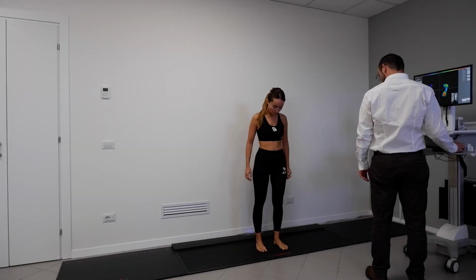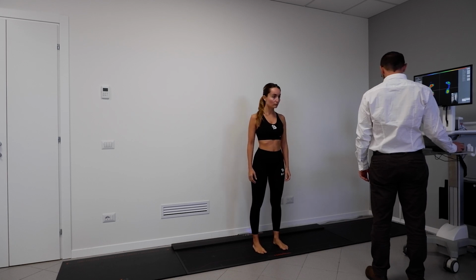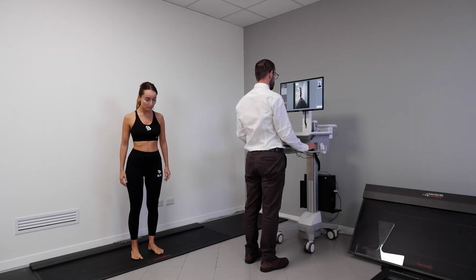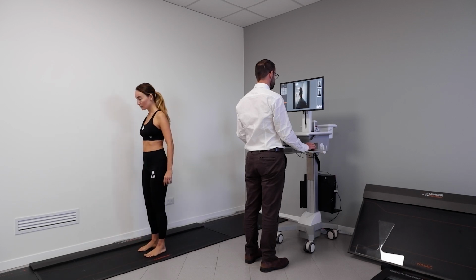Following the classical literature, let us place the patient on the platform with his feet in the Romberg position. That is, separated by 2 centimeters at the heels and aligned, with the pedalic axes extra-rotated 15 degrees, with his arms down at the sides and face forwards.